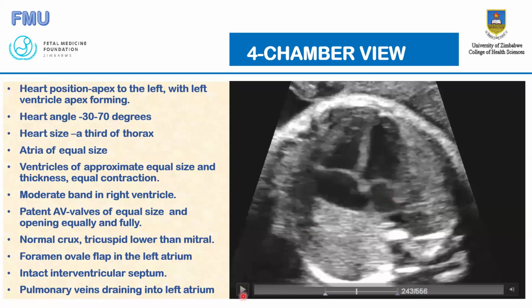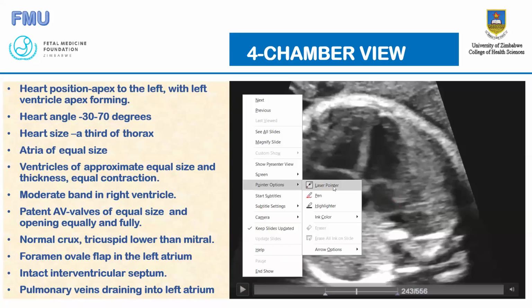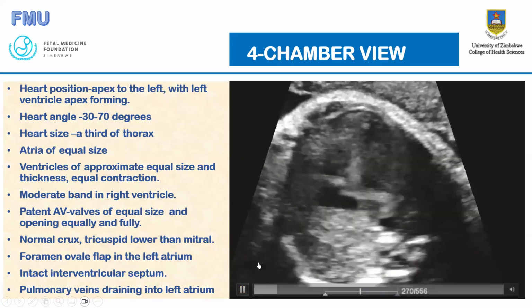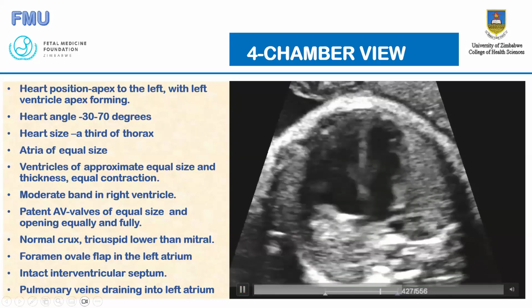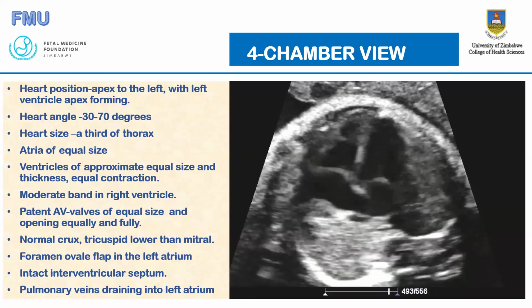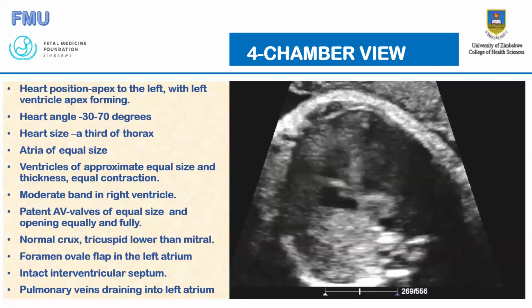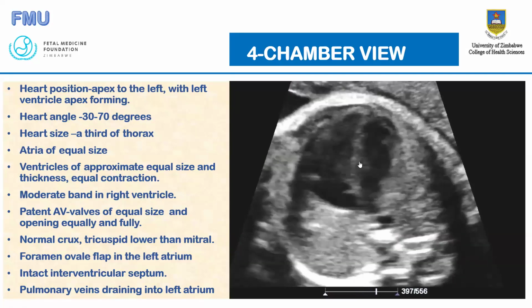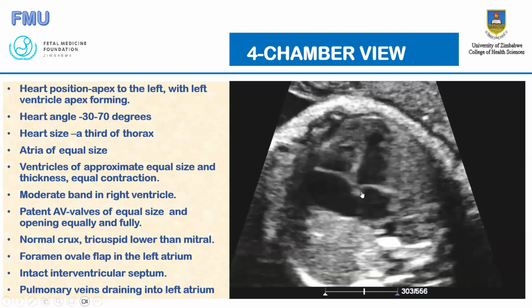When you are looking at the heart, we prefer that you examine the heart as it moves. So let's get the heart to move now. This is how you should be looking at the heart when the baby is in utero. You look at the heart when it is in motion, so that you don't only check the structures, but you also get the chance to see if the valves are indeed opening.